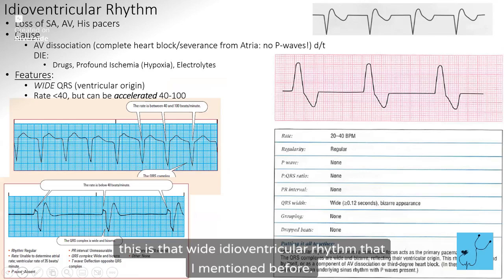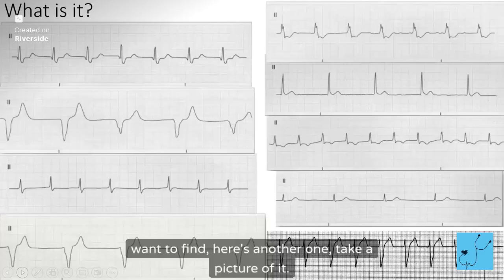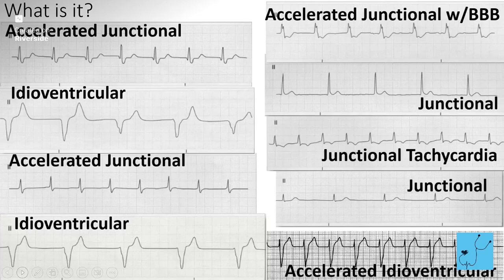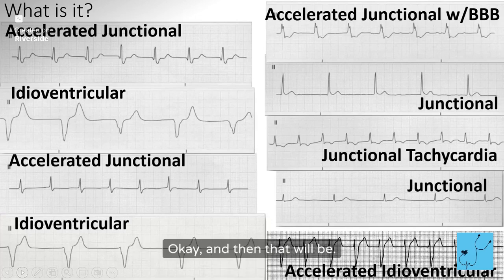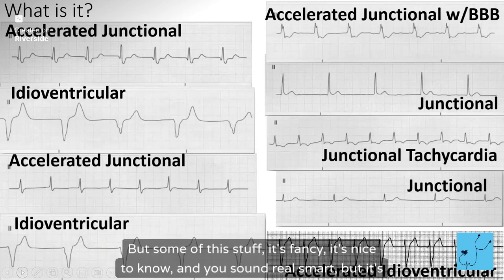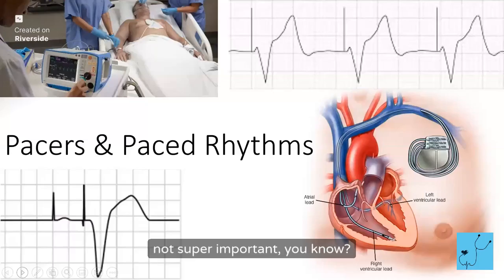This is that wide idioventricular rhythm that I mentioned before. I want to find, here's another one, take a picture of it. I just want to talk a little bit about PVCs and PACs. Some of this stuff is fancy, it's nice to know, and you sound real smart, but it's not super important, you know?